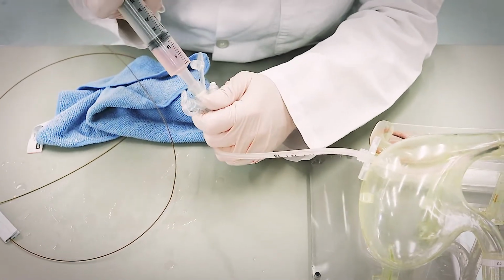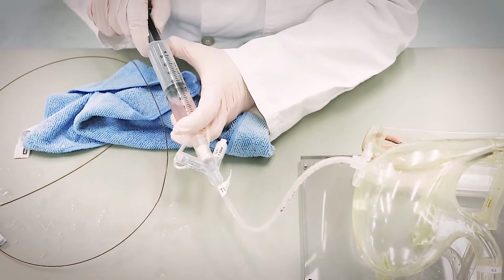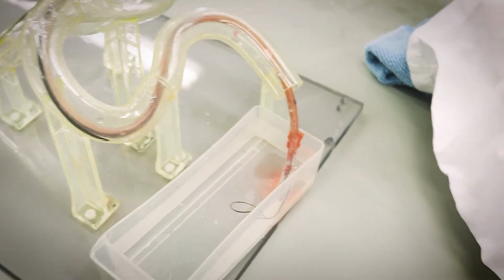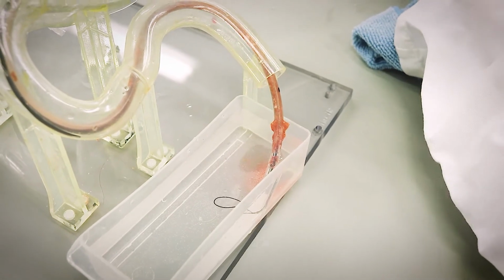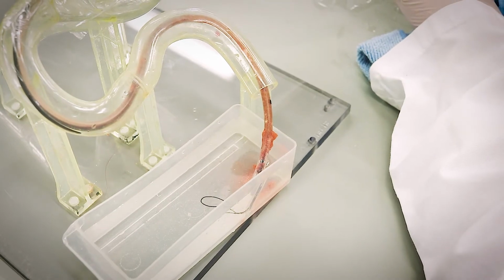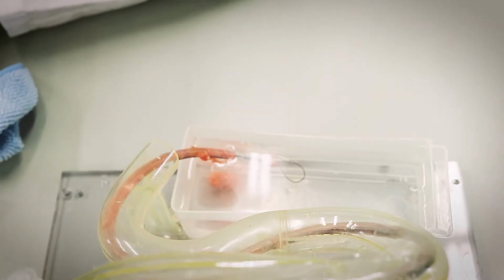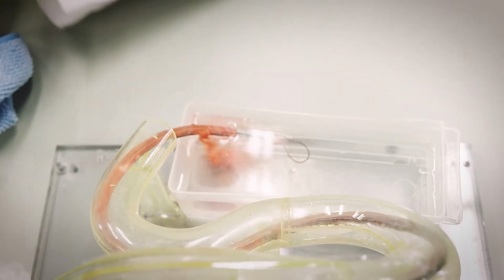I like to do the little pump. It definitely helps push some of that stuff back and forth. Sometimes it's good to just hold a pressure on there for 10 to 15 seconds, not being in any hurry to release it, just in case, as you can see here, very, very slowly some of that stuff is moving through the tube. So if I just keep that pressure, it's slowly coming out. There's a lot that you're not going to be aware of that's happening in there.